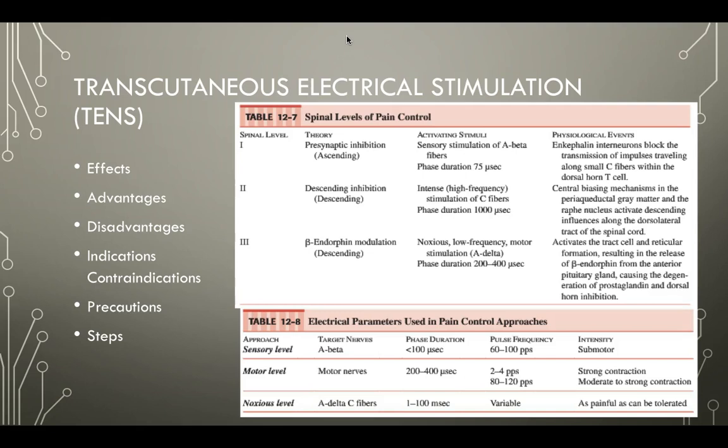So talking about TENS, it's a current applied across the skin, which is really all of our E-stim unless you have implantable electrodes. But again, it has kind of turned into this idea that TENS describes the pain relief aspects of E-stim, so it can encompass many different forms.